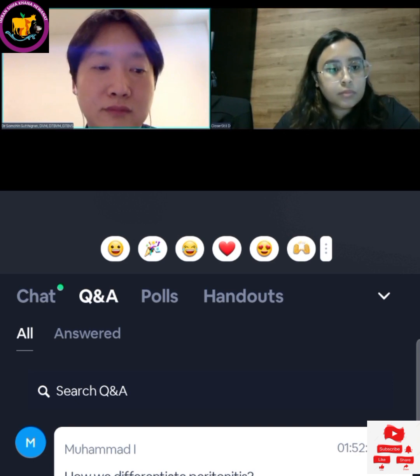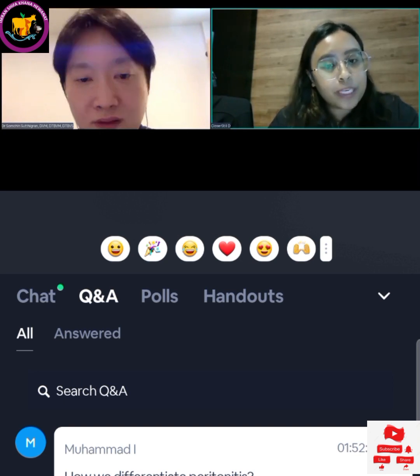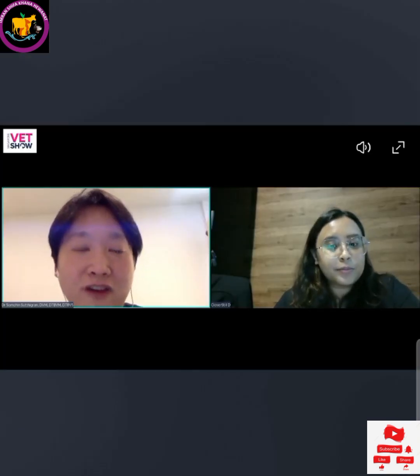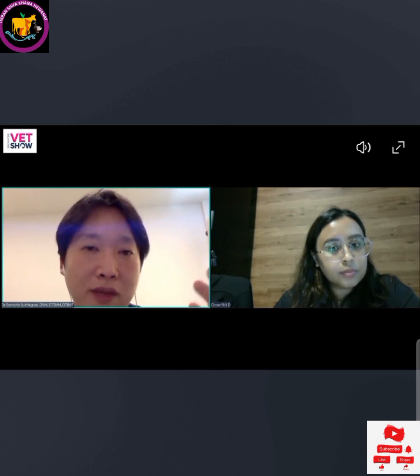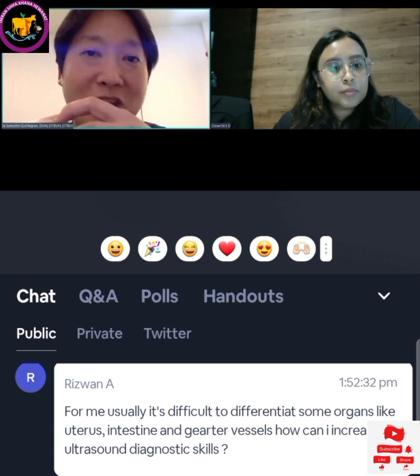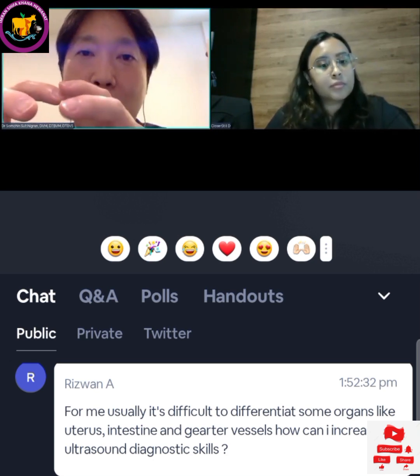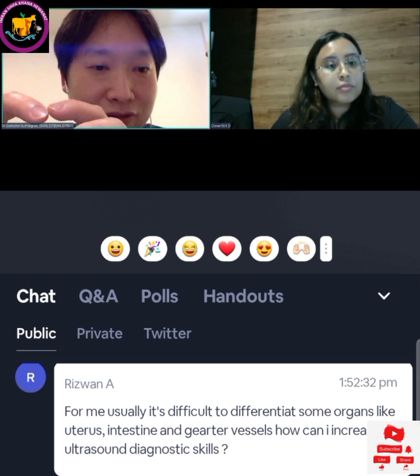Okay, that's great. For the next question, what can be the criteria for detecting mass in the urinary bladder or blood clot? Yeah, it's a good question because we found a lot of cases like this. For the blood clot, I use two techniques. Firstly, I reposition the patient to standing. If it is only a blood clot, it will change position following gravity. But in some cases, the blood is attached to the urinary bladder wall and may not change when we change position of the patient. You can use the color Doppler in your machine to detect the vascularization. If it is a blood clot, there is no vascularization, but if it is a mass, it has vascularization in the parenchyma.